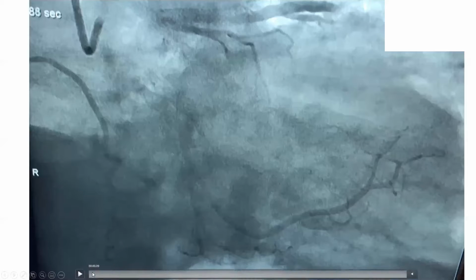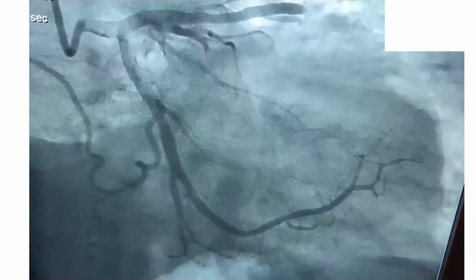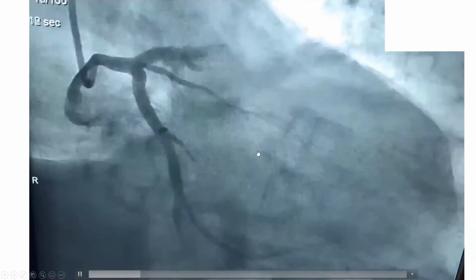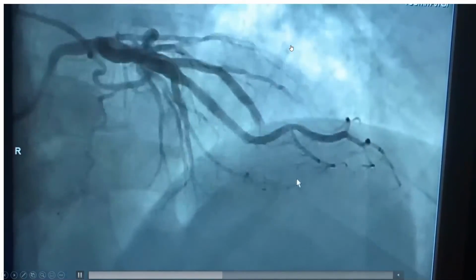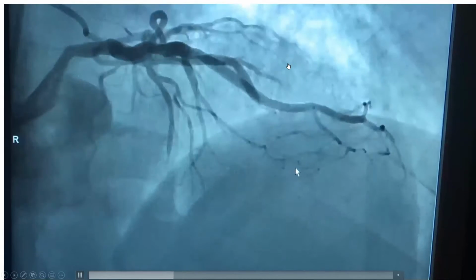Now, could it be a thrombus? A thrombus also typically, a fresh thrombus, will grab on to contrast. So you will see dye stain, dye hang up in that area. This doesn't look like it. Between injections, I don't see any dye hanging. So it is the third differential diagnosis, which is air embolism.